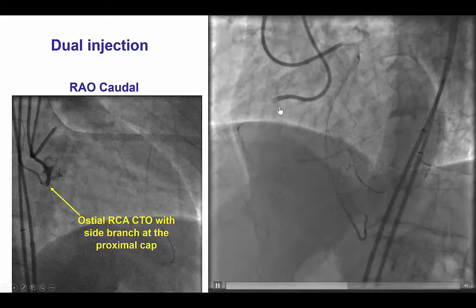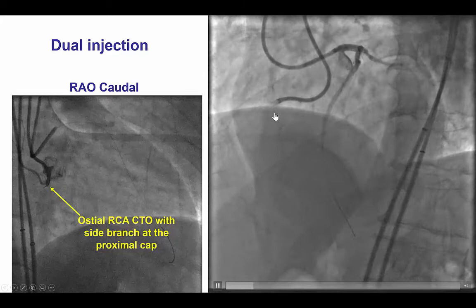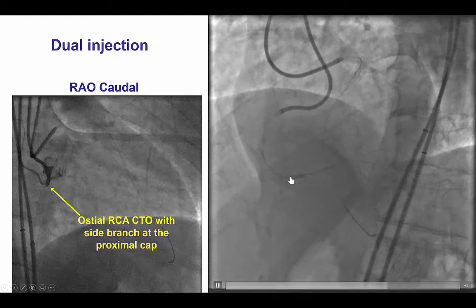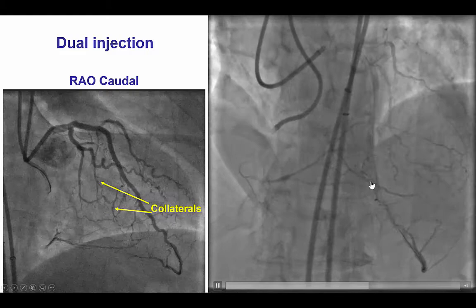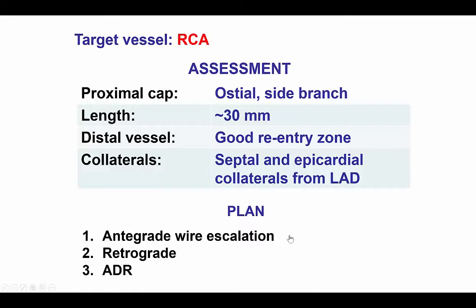The images here are from the dual injection, and because of severe dampening of the right guide catheter, there was no antegrade injection. There is filling of the distal right coronary artery, which is a large caliber vessel, done mainly via septal collaterals as well as some epicardial collaterals from the circumflex.